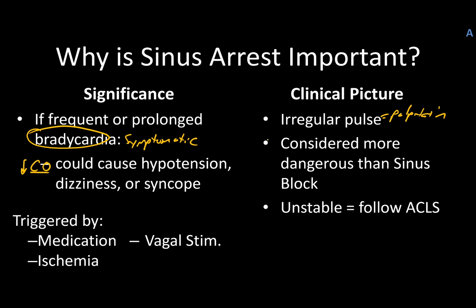What separates these two ultimately is that sinus arrest is considered more dangerous than sinus block, and that makes sense, right? The fact that that sinus node didn't even turn on or didn't even try to make a beat during those instances, that's why it's worth digging into and being able to identify the difference.